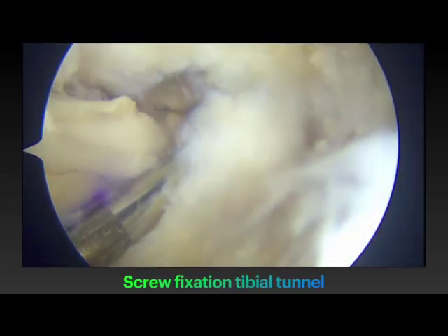And it is fixed into the tibial tunnel with a 7 by 20 mm screw. We aim to visualize the tip of the screw for adequate fixation.